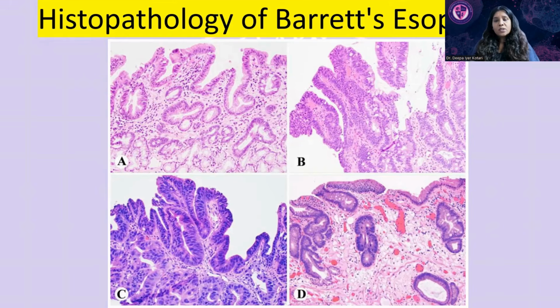So suppose there is some amount of active inflammation and ulceration in the patient, and suppose there is reactive atypia, which closely mimics a dysplastic change. Let's say the epithelium is showing abnormalities or mild architectural change, but the findings cannot be distinguished as inflammatory or dysplastic. There is some midway entity where you're not able to find out if it is reactive atypia or dysplastic. That is when you will use this particular category, indefinite for dysplasia.